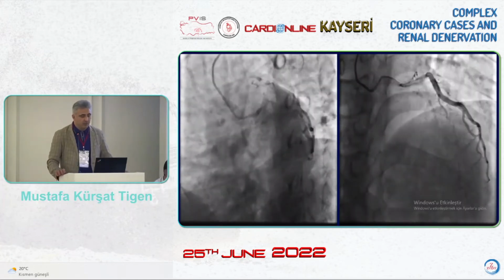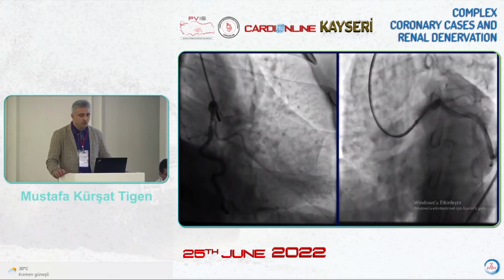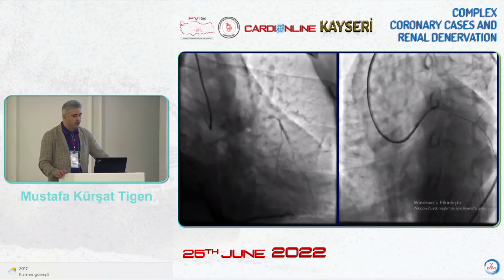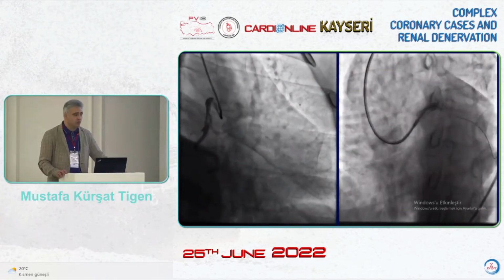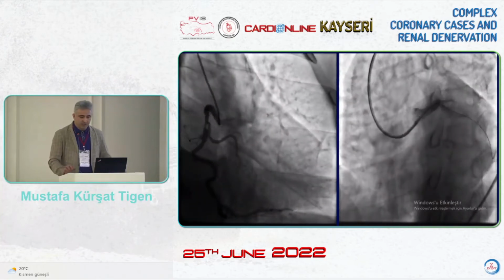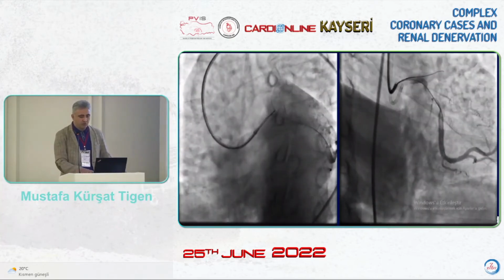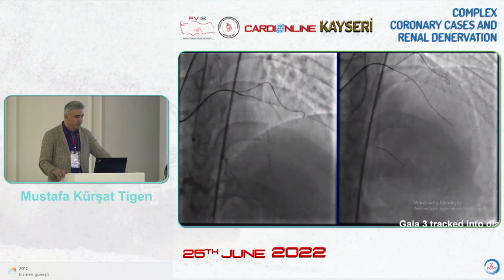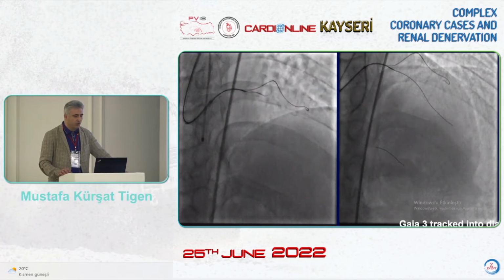Another total occlusion, LAD ostial segment, as you can see. For penetration capability, we have the extra catheter and a microcatheter to reach the penetration area, and we can have the penetration. After that, we have to confirm whether the wire is within the true lumen or not.